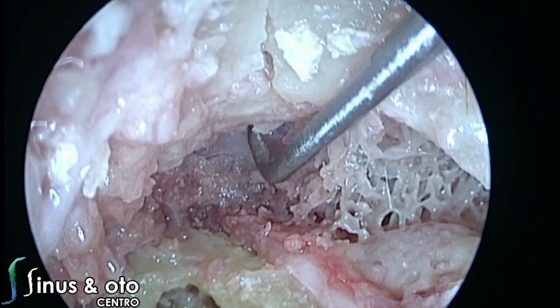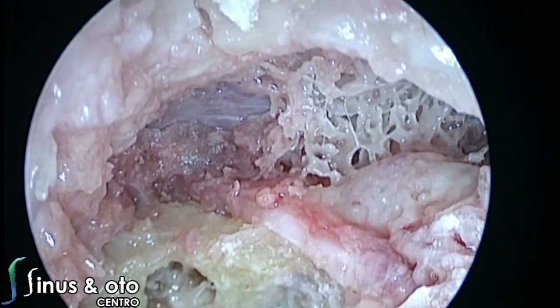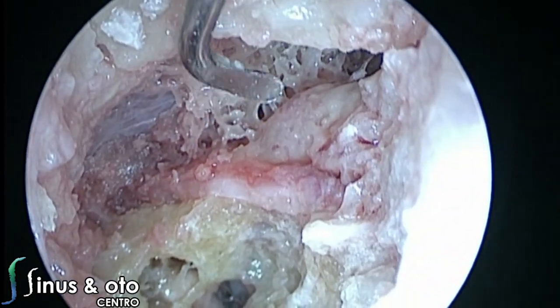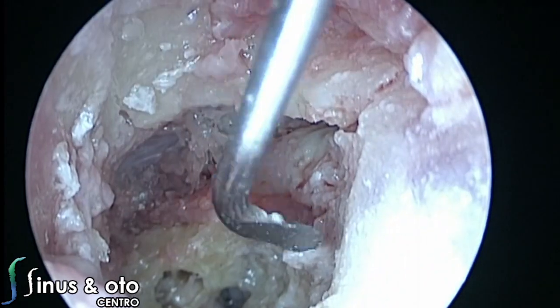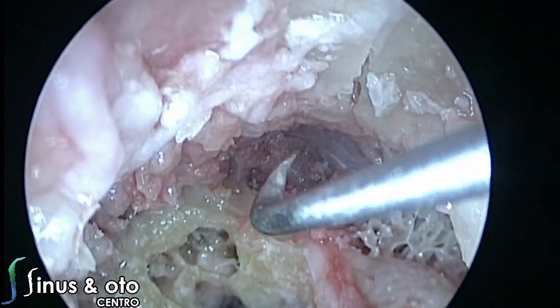Middle fossa dura. And you see the close relationship between the middle fossa dura, the geniculate ganglion, the greater petrosal superficial nerve, and the eustachian tube. Lateral semicircular canal is there. The tegmen is there. You can see the region of the facial recess a little bit over there.